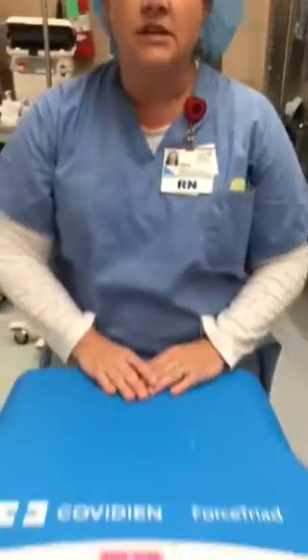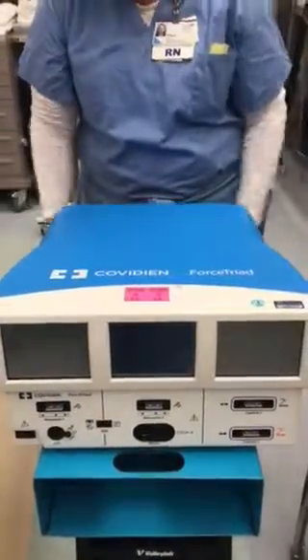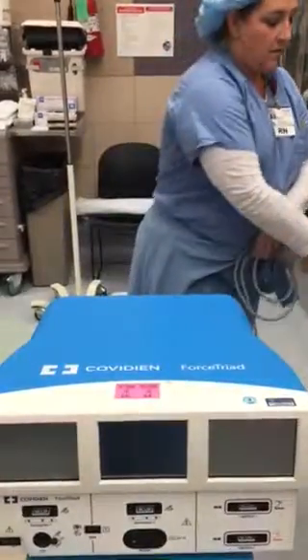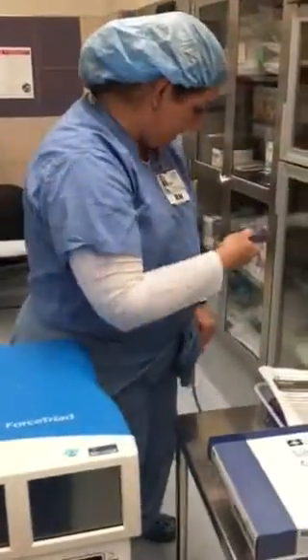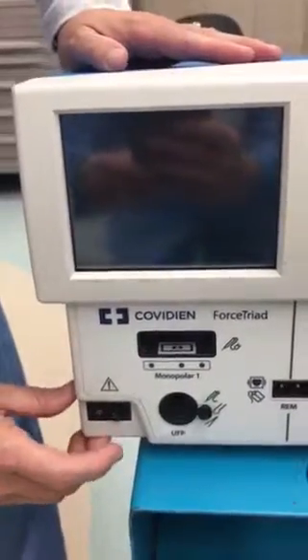First, we would get the machine up from the operating room. This is the Ligasure machine. First thing I would do is plug the machine in to the wall. Remember, all of our OR equipment needs to be grounded. This has a 3-prong plug. I would plug it in to a 3-prong outlet and turn the machine on. The on-off button is right here in the front on the lower left-hand corner.